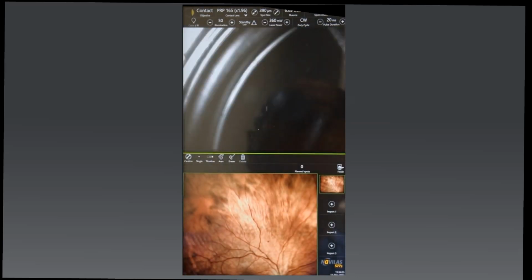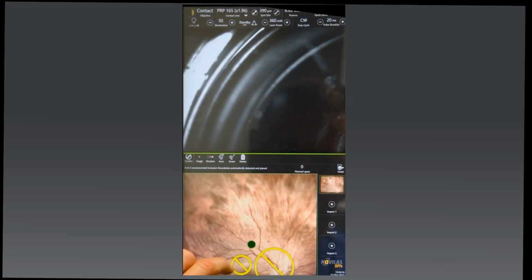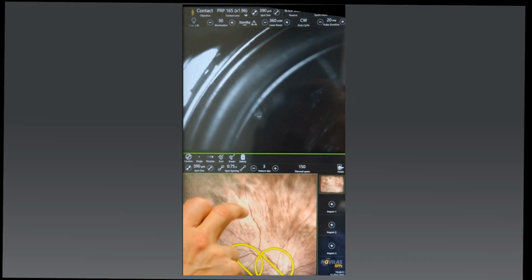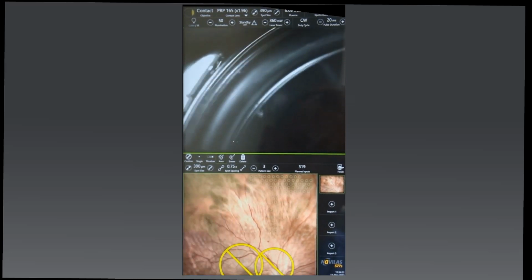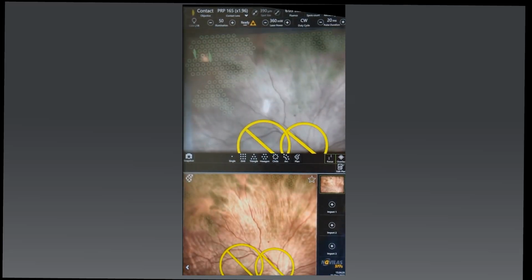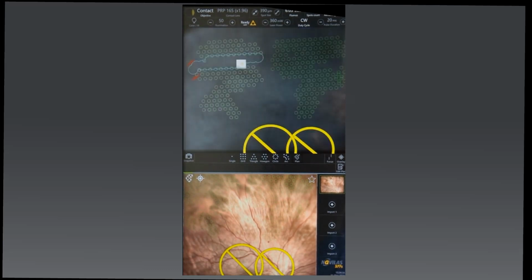So, some of them had treatment, but they hadn't had enough PRP. There are a whole load of reasons, and obviously we weren't doing face-to-face slit lamp PRP at the time. We were having to do them in theatre as well. So there are multiple challenges, but anything that enables us to get PRP more timely and more complete is going to be a good thing. So we're really keen to get as many patients through this pathway as we can.